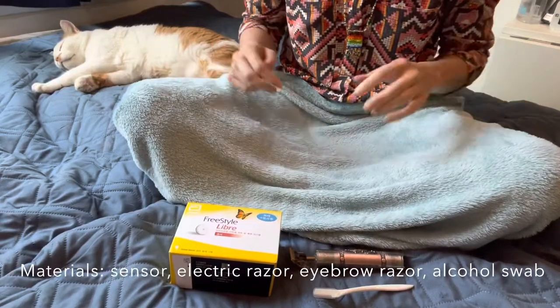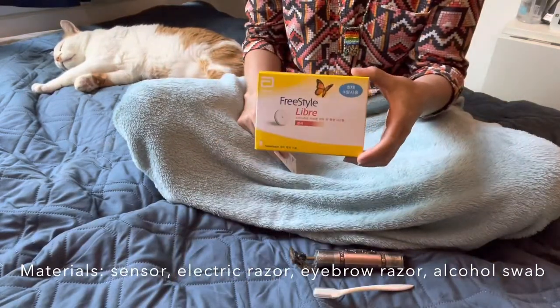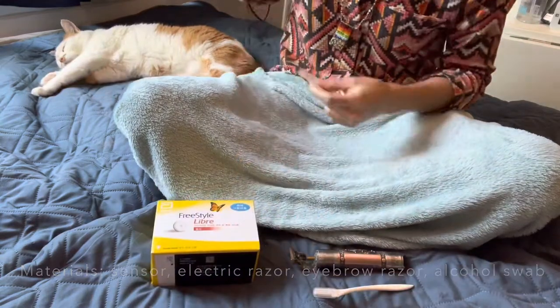This video is for anyone who wants to use a Freestyle LibreLink sensor on their cat.